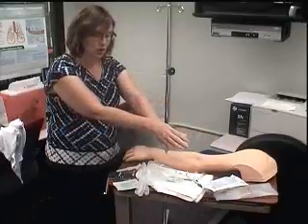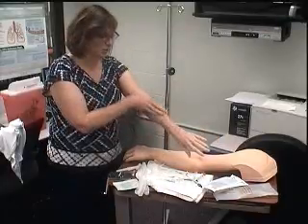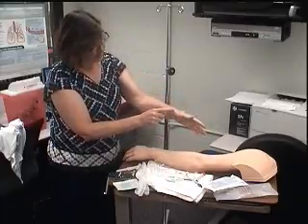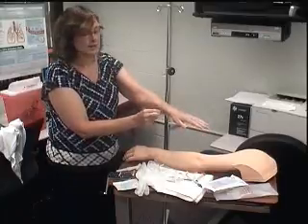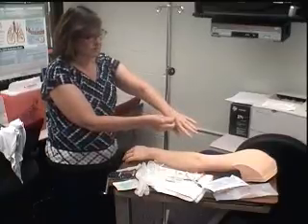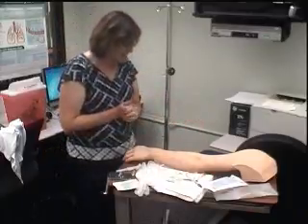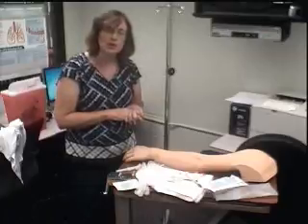I'm usually going to start lower and go in from the most distal, then go up, because if I put the IV in here, and let's say I put it in here, I couldn't put it lower because once I pull it out, it could leak in the tissue. So I want to start lower and then go higher, making sure to not use the same vein distally that I'd used before.